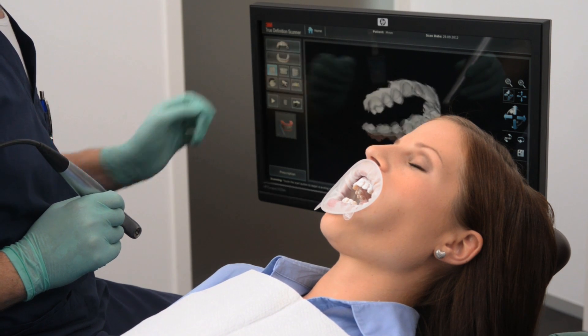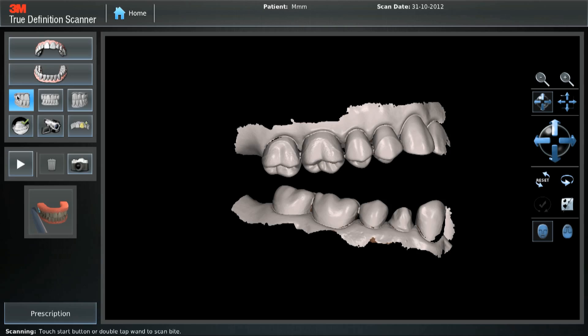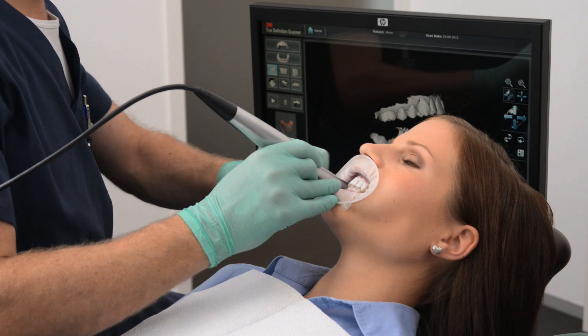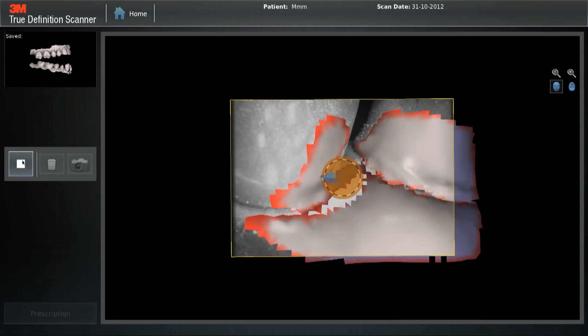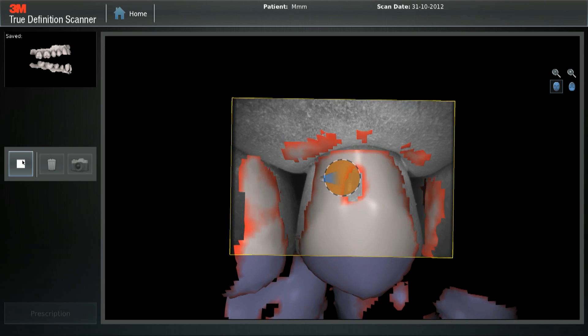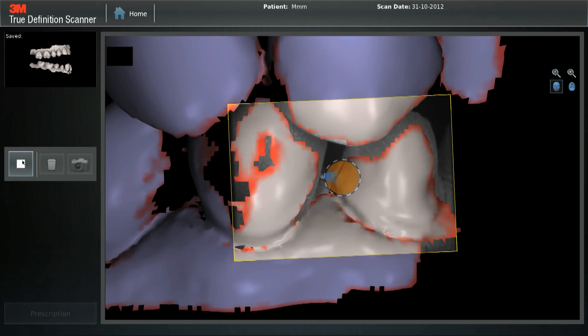Posterior Bite Registration. To scan the bite, choose the correct bite icon — in this case, the bite icon for the right side of the patient. The mandibular and maxillary scans should display parallel to each other, but not in occlusion. Before starting the scan, ensure the patient has closed correctly. Scan the gingival margins in either direction. Scan 3 to 5 teeth in a rectangle. No need to fill in the holes. Make sure to complete the rectangle.